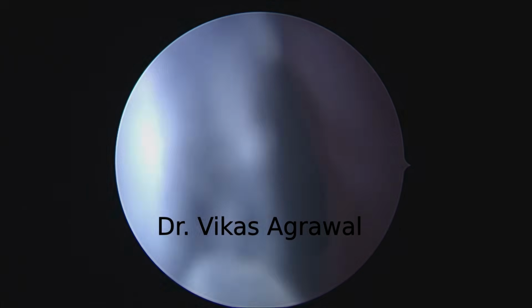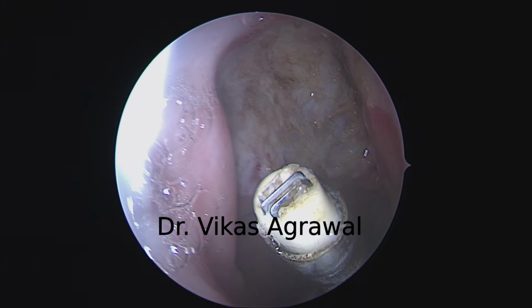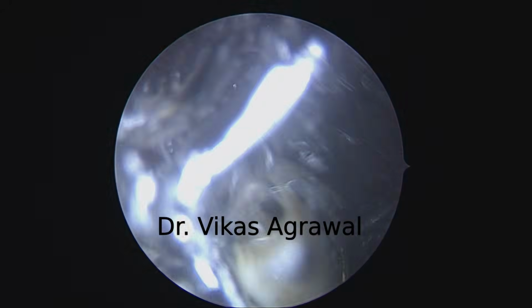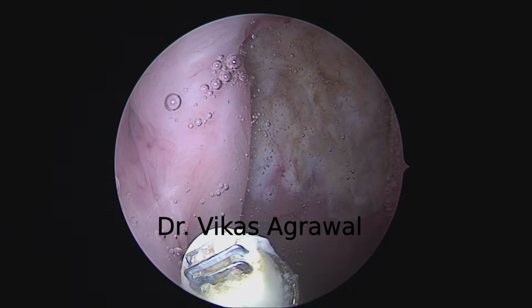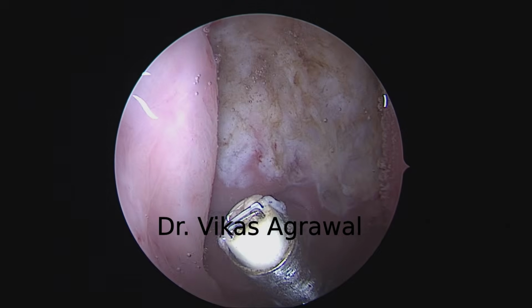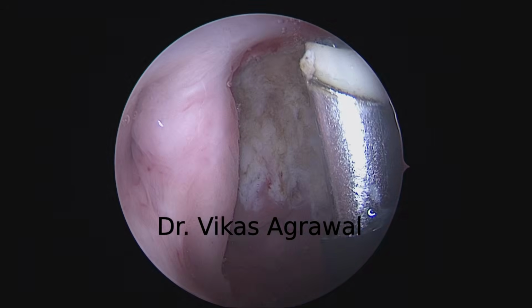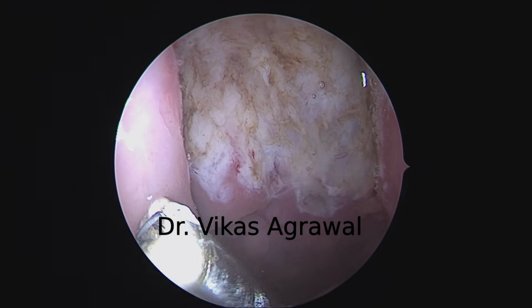Can you pour some saline? Thank you. So, as you can see, that's the eustachian tube. On the right side, decent work has been done on the superior boundary as well as the lateral boundary anteriorly.